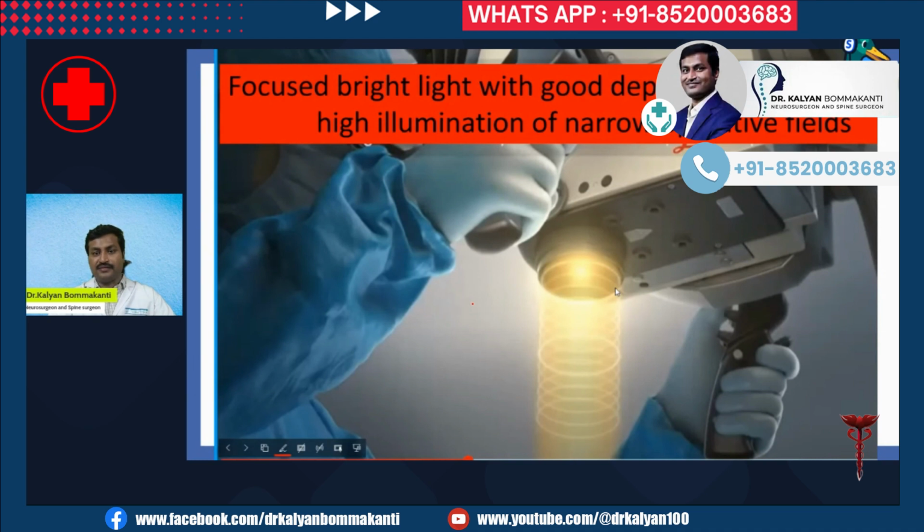The focused light. The light is very strong and very focused. You can direct it through small apertures, which is typical of neurosurgery. You have to reach the tumor through very small openings. This microscope effectively does this.